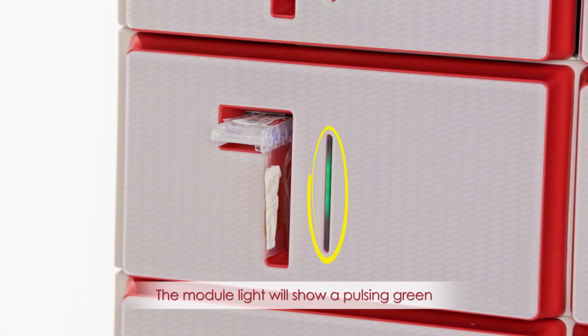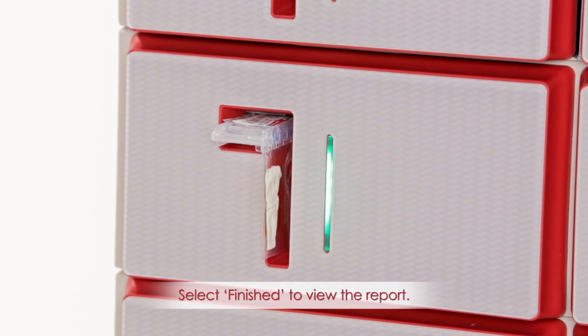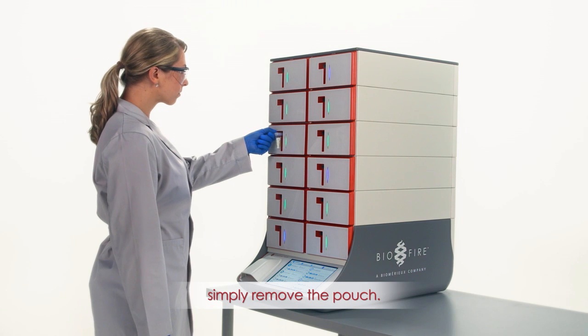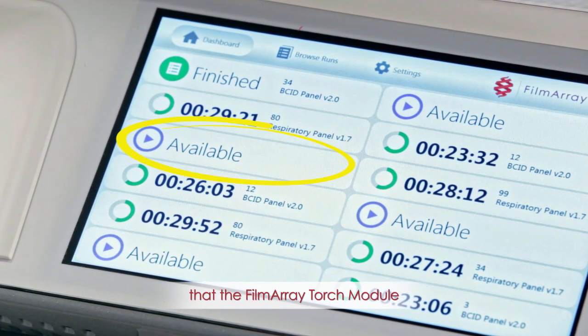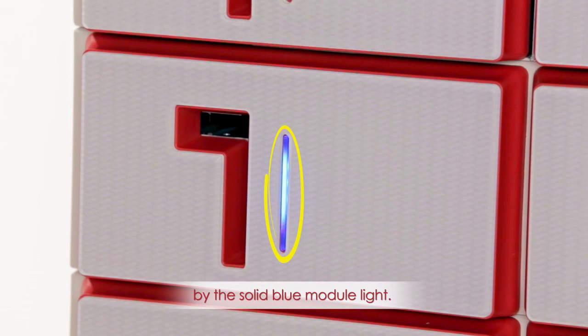The module light will show a pulsing green to indicate the test is complete. Select Finished to view the report. If you wish to view the report at a later time, simply remove the pouch. Once the pouch is removed, the run is cleared, and the dashboard displays that the FilmArray Torch module is available for another run, as indicated by the solid blue module light.